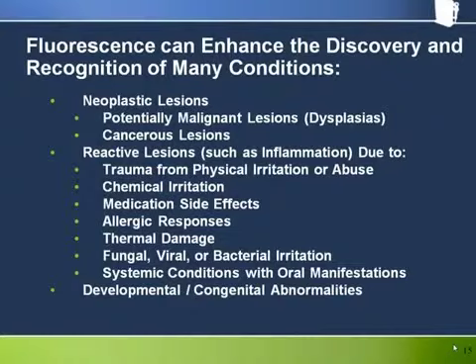We focused on the reasons why we expect to see a loss of fluorescence from dysplasia and cancer. However, it is important to understand that fluorescence pattern changes are associated with many different types of lesions. Moreover, this is a benefit rather than a limitation of fluorescence visualization. To be sure, neoplastic lesions are arguably the most serious and life-threatening in the spectrum of diseases that affect the oral cavity. However, the many other types of conditions are definitely worthy of the clinician's attention and can have a significant effect on the quality of life of the patient.